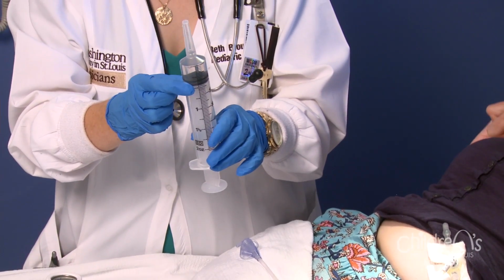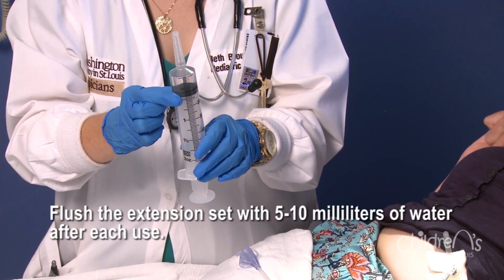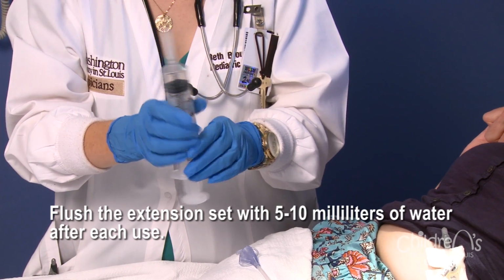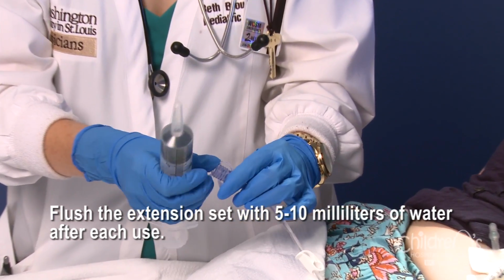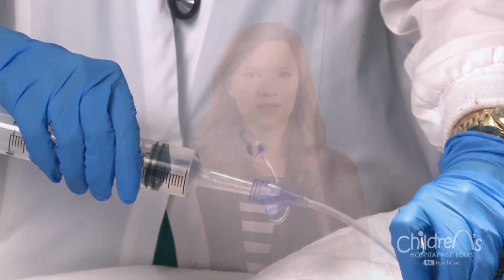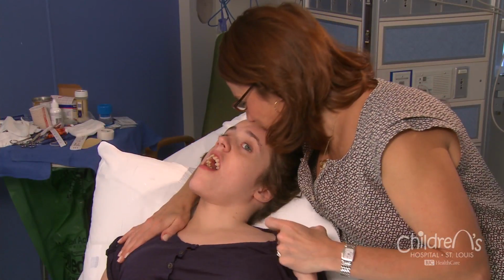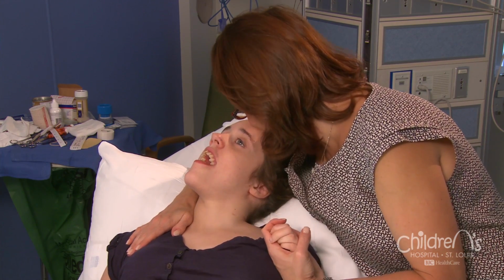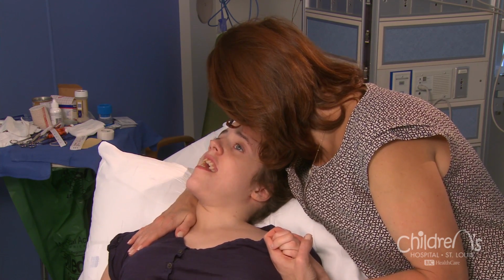Remember, buttons should be flushed with 5 to 10 milliliters of water after every feeding and after giving medications. It should also be flushed once a day, even when not in use, to prevent clogging. Take time to nurture your child during feedings. This is an important time to continue to provide your child with pleasant sensations and opportunities for bonding. This may include holding, rocking, and talking to your child during feedings.